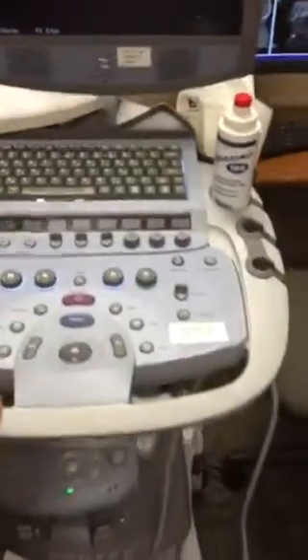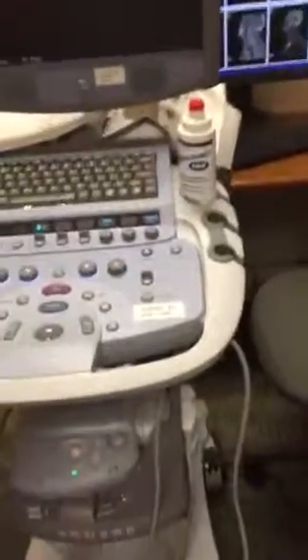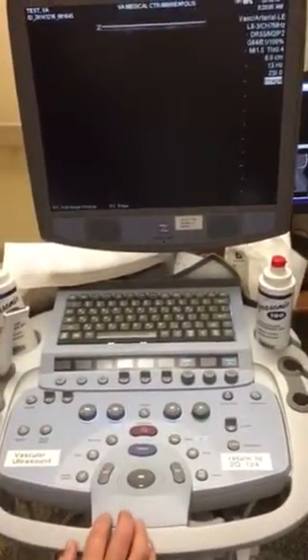So let's go look at your carotid, popliteal. Your popliteal. Do you have a pencil? No. Okay. Carotid, we already did it, so I don't know if we have to do it again. We could just practice on the road for that.